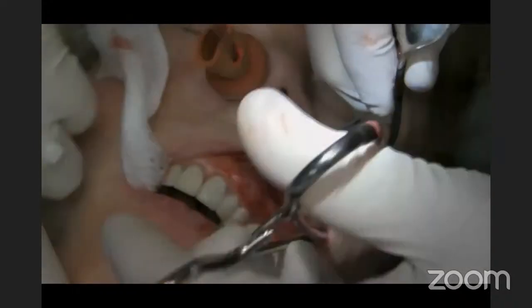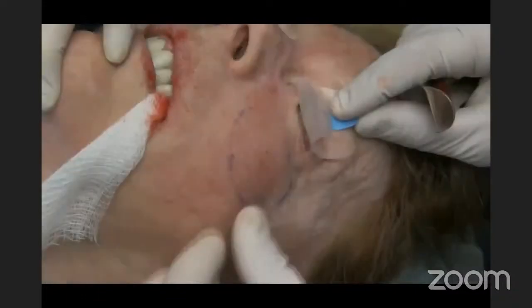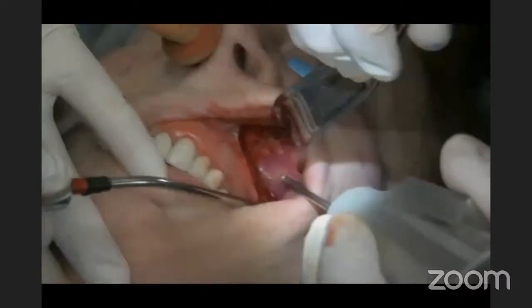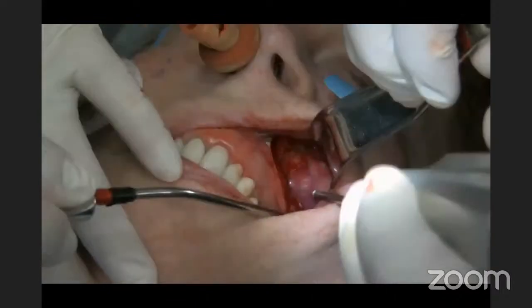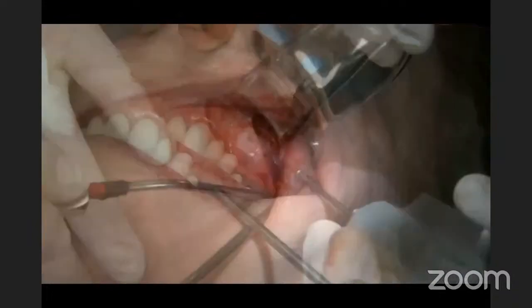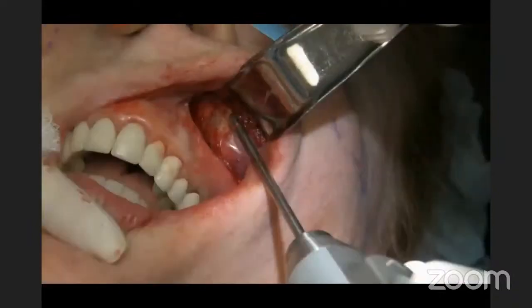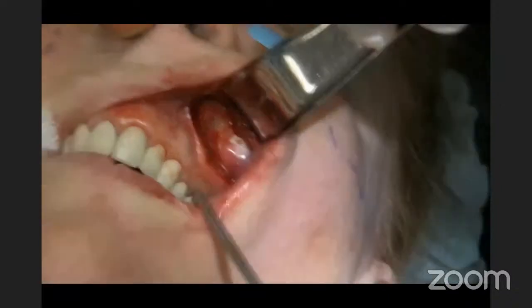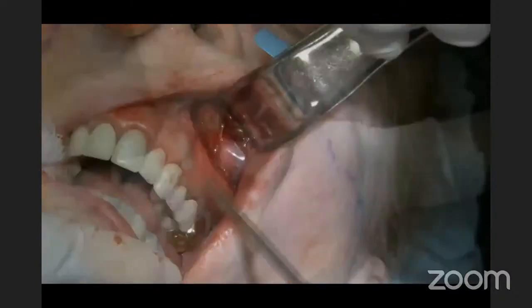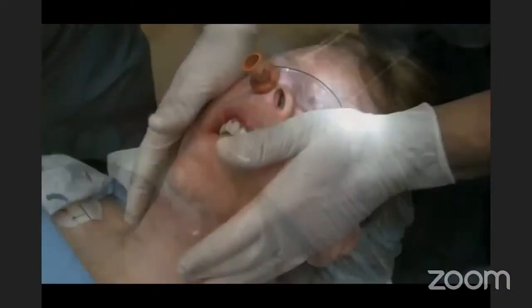I'm irrigating with clindamycin antibiotic solution. We have a tonsil clamp with the left side implant. The implant is placed, and if your pocket is just bigger than the implant, these are anatomic, and they'll kind of auto position on the bone right into the perfect position. Once they're in place, what I like to do is push on the implant, pull down on the lip, take my palm and push on the implant, then go back in the mouth to see if the implant was extruded. If it's extruded, the pocket's too small or the implant's too big, it needs to be adjusted.